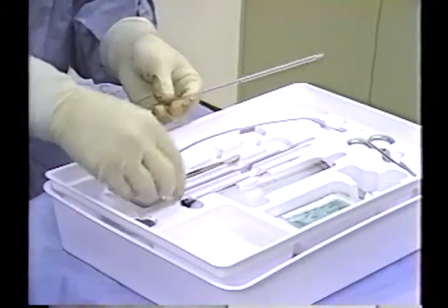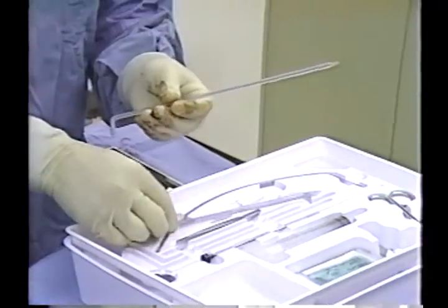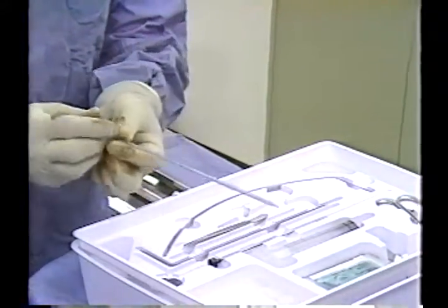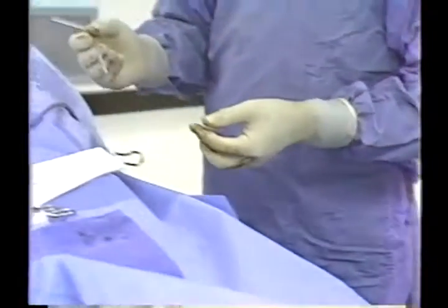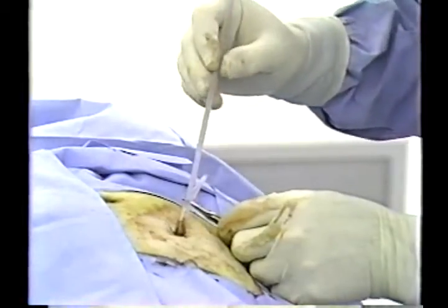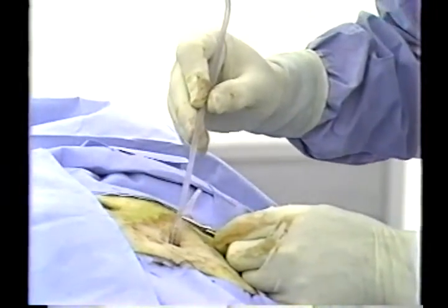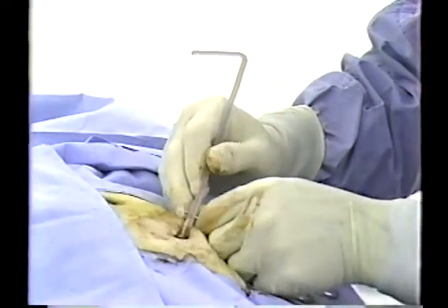The tray holds a 3/16 inch and a 1/4 inch diameter plastic dilator. The 3/16 inch dilator is wetted in the saline solution and inserted into the quill catheter guide by slowly moving the dilator in and out gently several times and rotating it at the same time, enlarging the catheter guide.